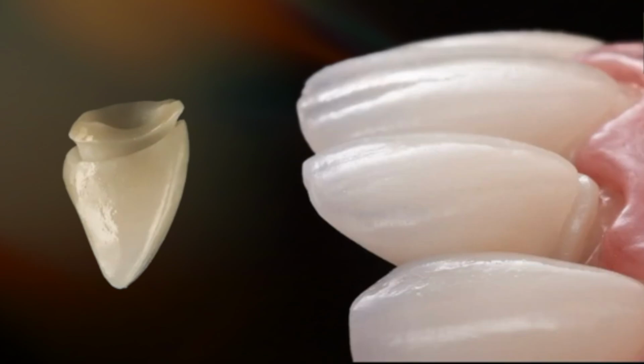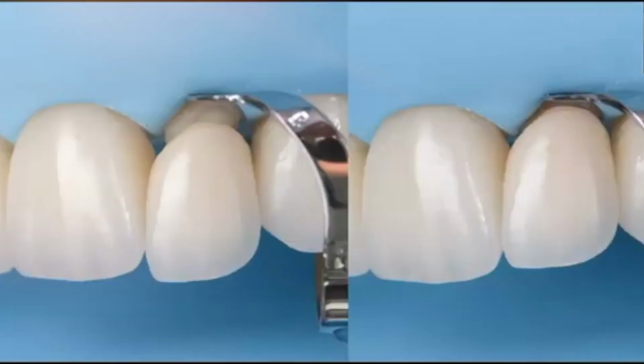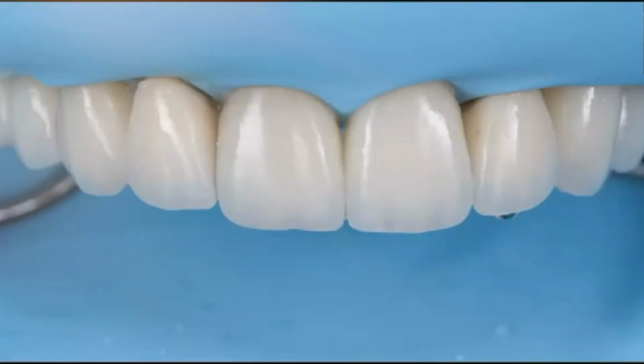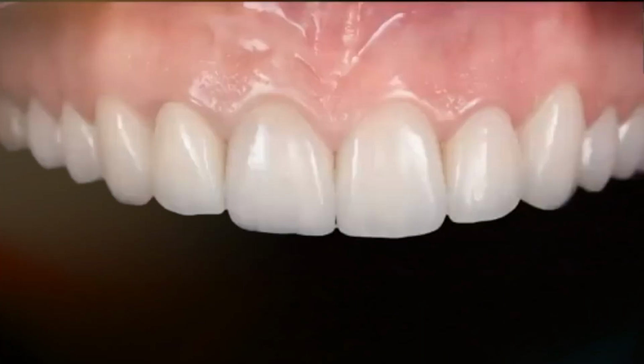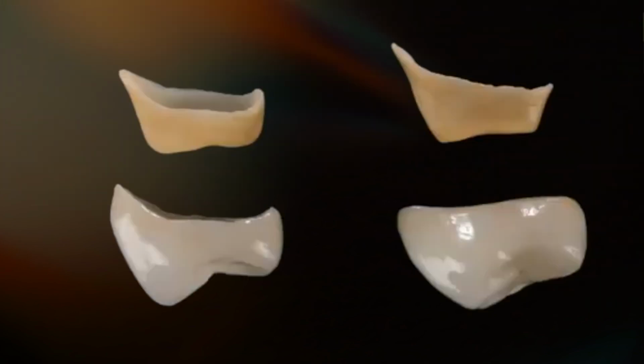Now, the advantages of this technique is you can, technically speaking, block any color. So it doesn't matter if the tooth is black, for example, like in this case. It's easy for the dentist, just needs to prep more. What are the disadvantages? It's expensive. Technically speaking, the technician has to make two restorations. It's time consuming because many times you cannot make them both in one CAD design.